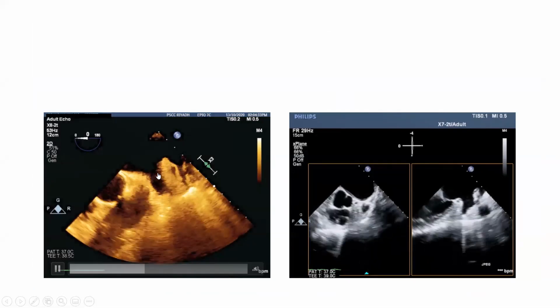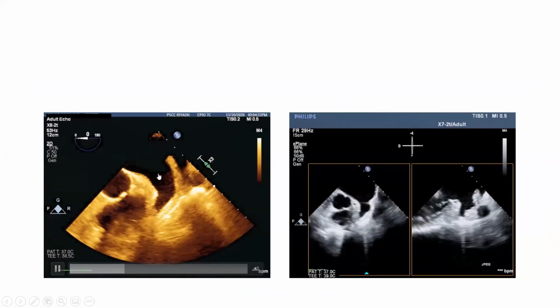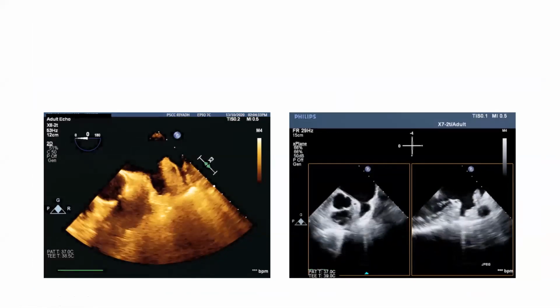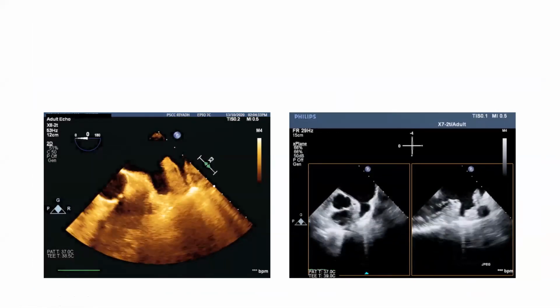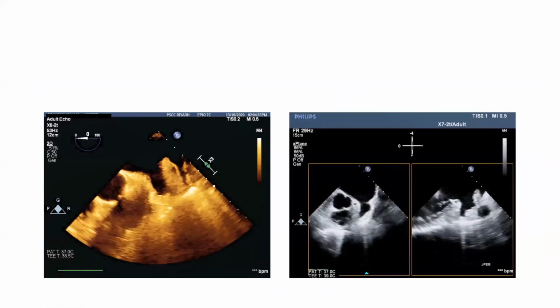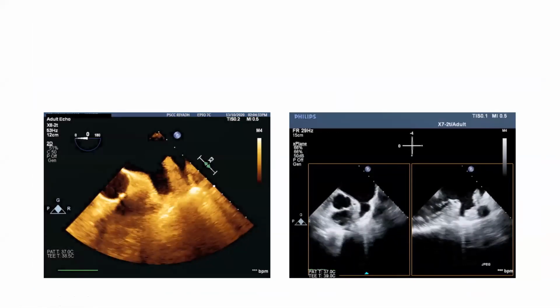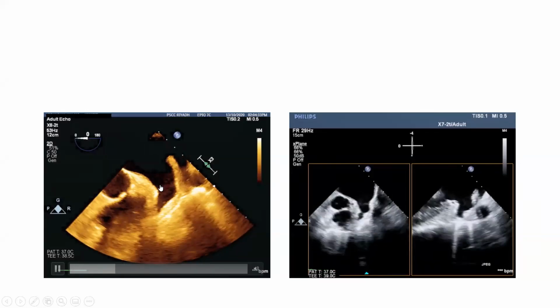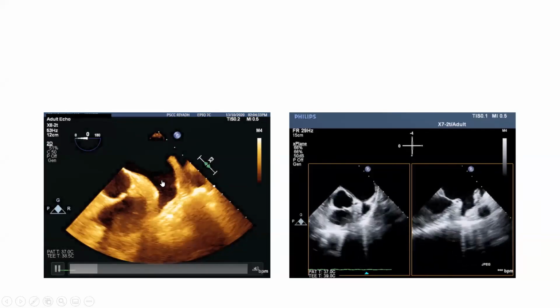You have to open it. You go to the lateral, it is an anterolateral structure, of course. For this one, you need to have all three hands working at this point. First, you stress your probe with your right hand, and then you do flexion, good flexion, to open the left atrial appendage, and a little bit up and down to get the view.